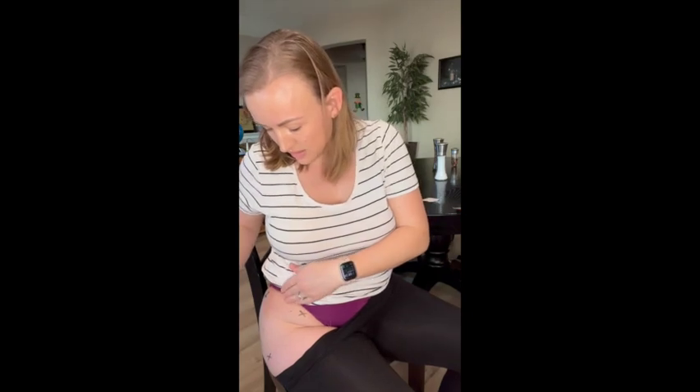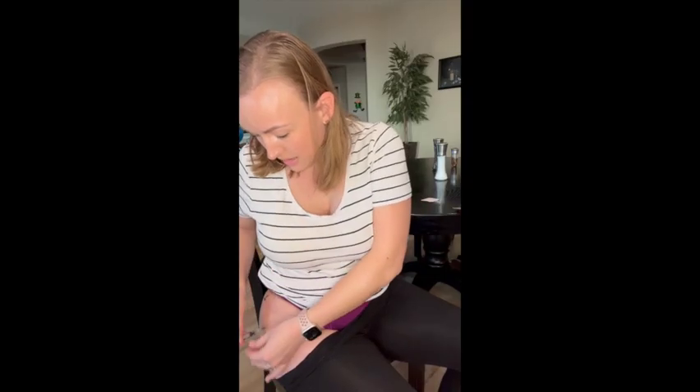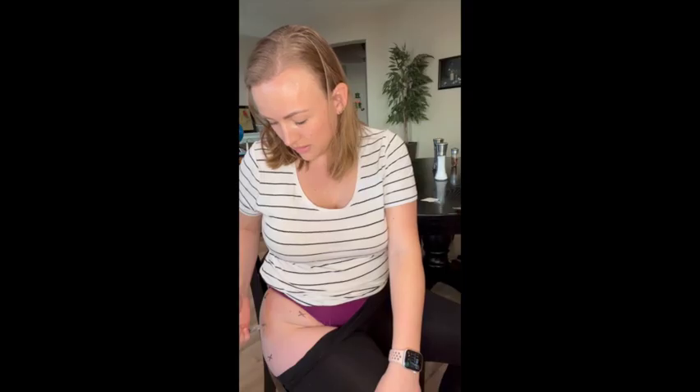I'm going to be going in at a 90-degree angle. This is a one-and-a-half inch needle. You want the longer needles for this muscle because it's a deep muscle and you want to get it into the muscle and not just into the fat, which is what sits on top of the muscle. We're going to go straight in — not bad. If your clinic advises you, you can do aspiration — you can pull back on the plunger a little bit. I don't see any blood, so I'm good to inject.